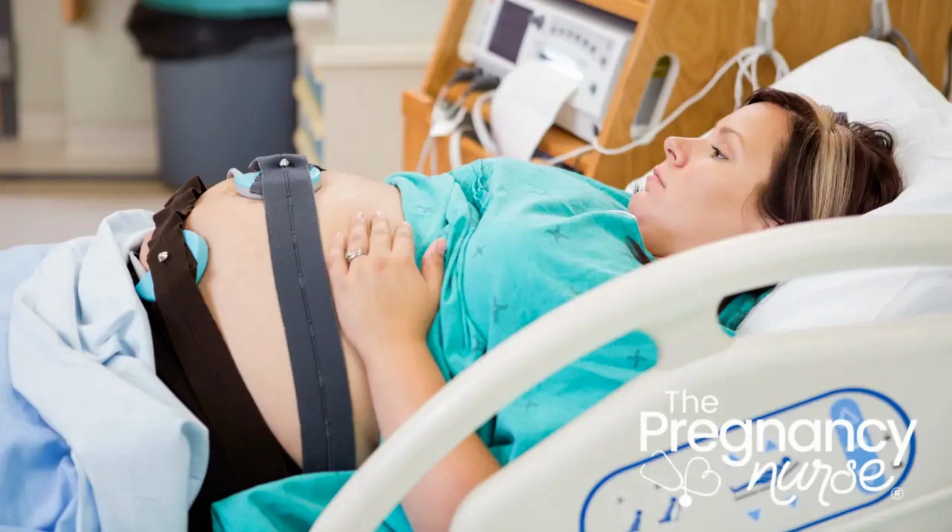Okay, so the baby's heart rate is monitored by ultrasound most often. There are a few other ways that we can measure it. We're going to talk more about wireless monitoring, so stay tuned. But there's also something called a fetal scalp electrode that just goes in the very top of the baby's head. We put this in if baby isn't showing as well on the monitor as we would like, or there are some issues and we're just not getting a clear enough strip for us to feel comfortable. Of course, that's always up to you, but that might be something that they encourage you to have put in. It does go into the very tip of the baby's scalp, and sometimes babies do get a little scab from having it put in.